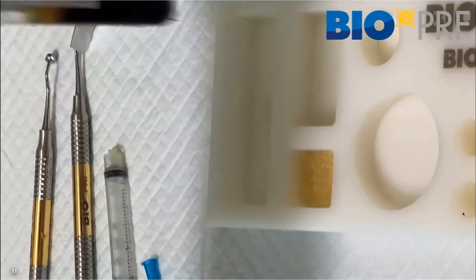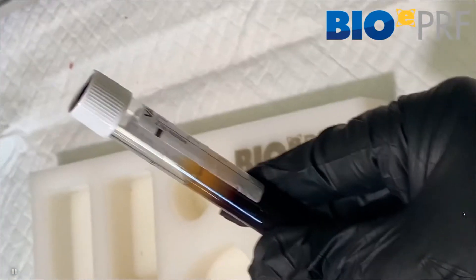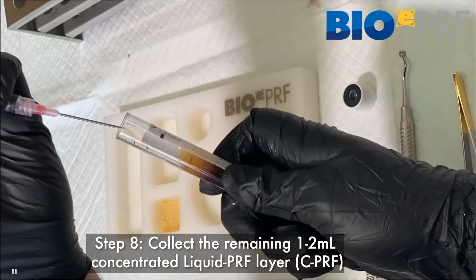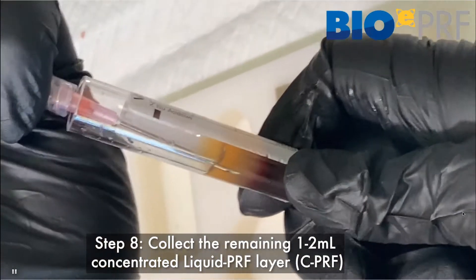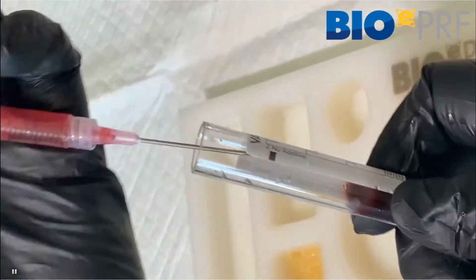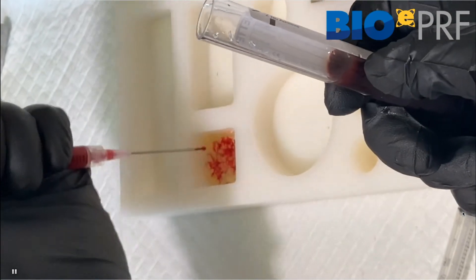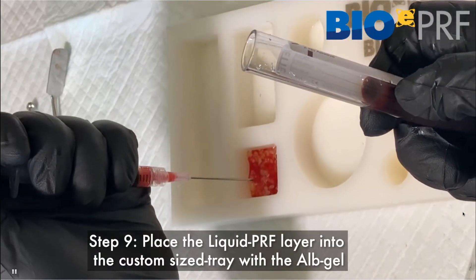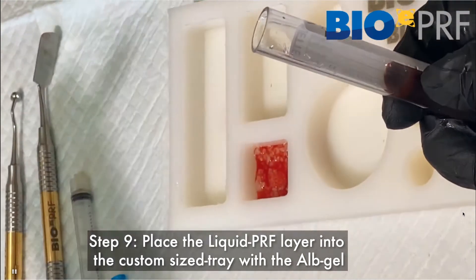The next step is to take the concentrated layer. When we draw this layer out, we're going to apply it onto the albumin gel, and that's going to allow that membrane to clot. That's where the fibrinogen and thrombin come into play and help with the clotting process. You can take a little bit of the red — there's no issue there. Once that's done, that's going to clot.